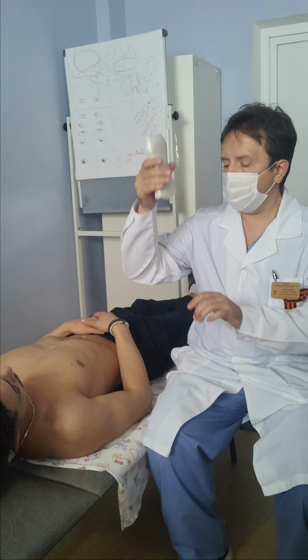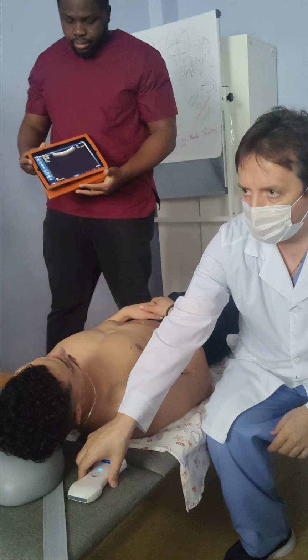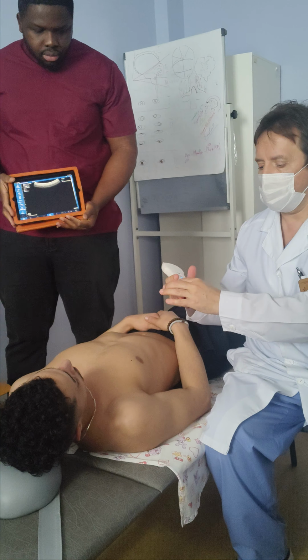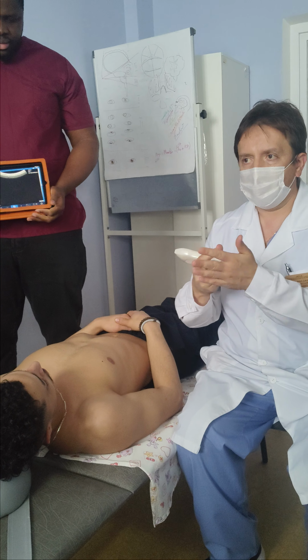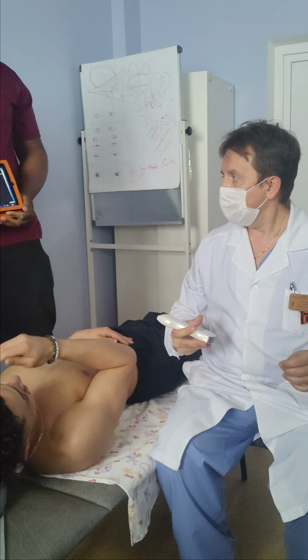Positioning. You must put on the probe somewhere. Only after that will we take it, prevent falling, and then take a position. Usually we are in gloves, that's why you may touch easily. I will try not to touch our patients.